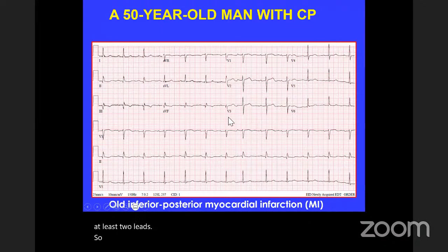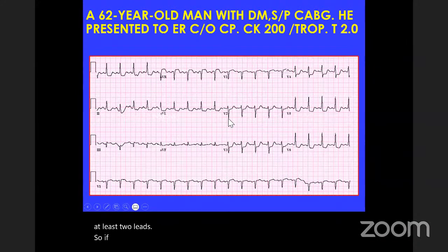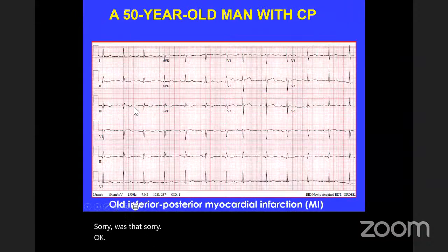If you see that one, it just indicates that the patient already had infarction before. Next one. Can we also say that the T inversion indicates old infarction in the previous one? Old infarction in inferior leads, just according to the Q waves, or also according to the T inversion in the same leads? Mainly the Q wave, pathologic Q waves.